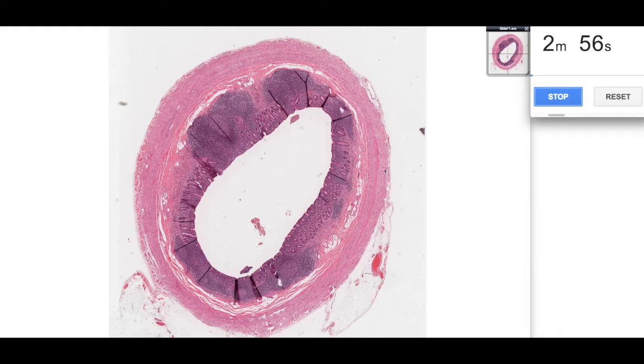So the appendix is one of the sites in the gastrointestinal tract that has a permanent aggregation of MALT. Now MALT is mucosa-associated lymphoid tissue, and you can see these very basophilic regions within this structure here. So this is the appendix cut in transverse section. Here's the lumen, and then we've got all of these very basophilic regions. These are the MALT, the mucosa-associated lymphoid tissue.